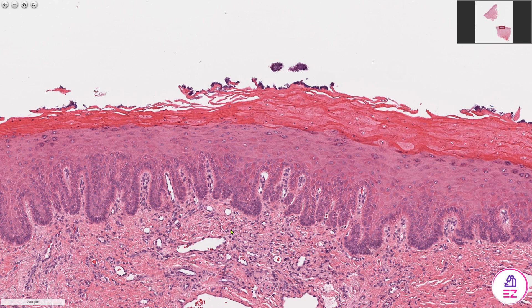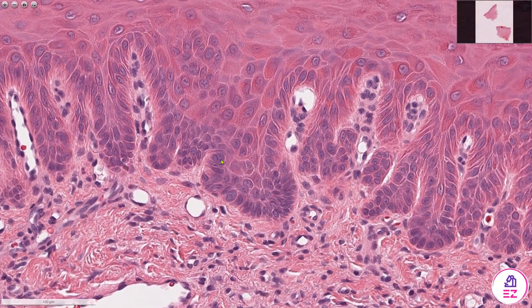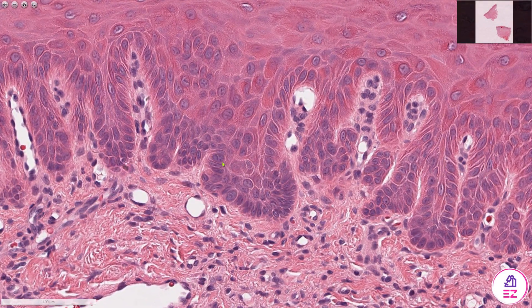In terms of cytological features, when I zoom in I can see that some of these nuclei are bigger than others, so there's a variation in nuclear size. These nuclei are taking up quite a large proportion of the cell, so we've got an increased nuclear to cytoplasmic ratio.